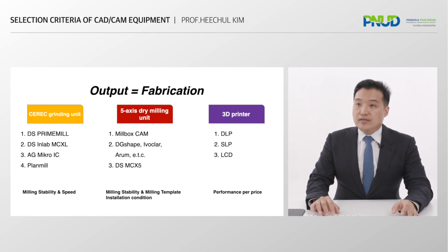I understand that decision making for a 3D printer is a tough one, even though it is fundamental in all orthodontic treatment. The 3D printer market is growing as fast as Moore's law states. I would recommend trying out a printer that costs under $10,000, depending on your needs.